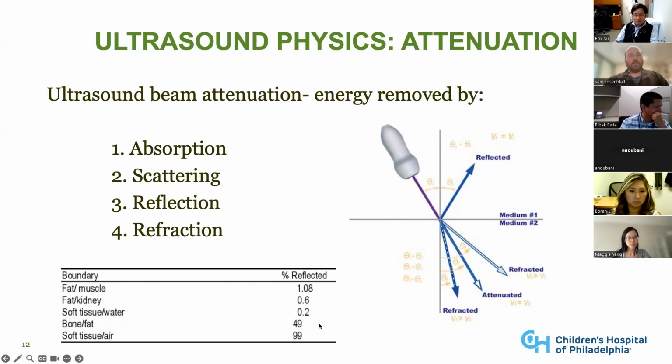That happens through absorption, right? Some of the tissues will absorb some of those ultrasound waves that are going in. Scattering, so it doesn't actually go anywhere, it just scatters to the side. You can have reflection coming off of it, as you can see up there. You can have refraction, where it goes down and then goes to the side and doesn't come back. So wavelengths that are reaching tissues with high attenuation or reflective coefficients don't give really any information beyond that surface and interface, because things are just bouncing off of it and coming back.